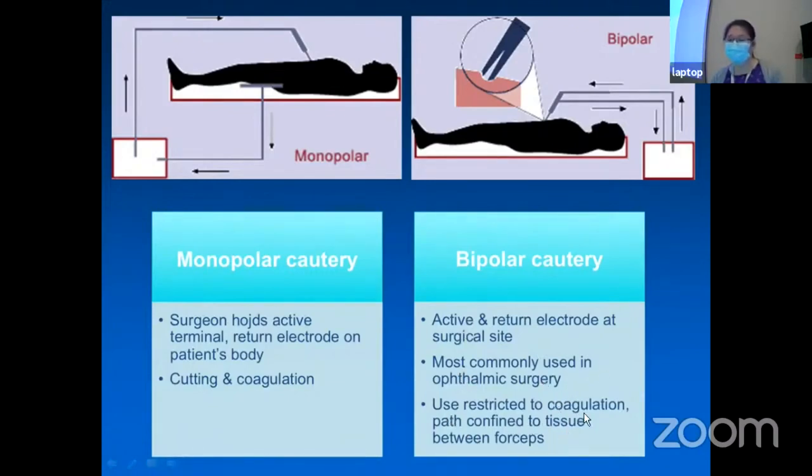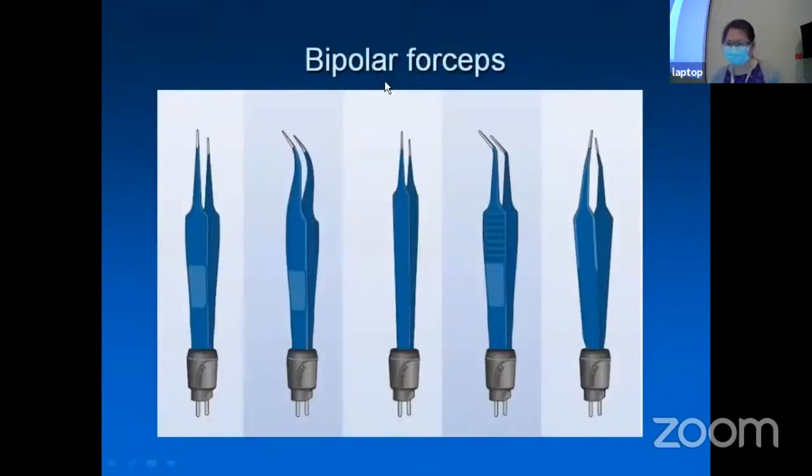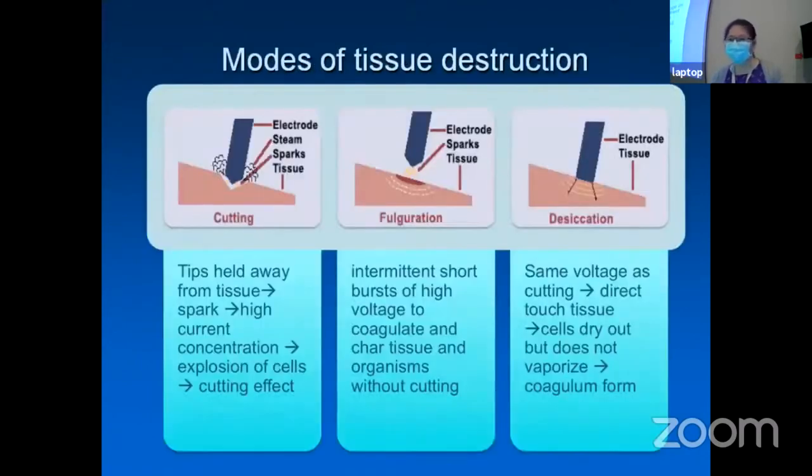The use is restricted to coagulation, and the path is confined to tissue between the forceps. Having said that, when you do cauterization of these vessels during your ECCEs, etc., it's better to have a gap between them, because the current actually travels between these two tines. Okay? For the bipolar forceps, there are many different types, different shapes, different curves, straight. Okay, and the modes of tissue destruction are as shown here.